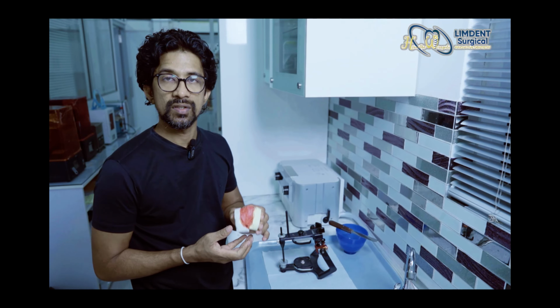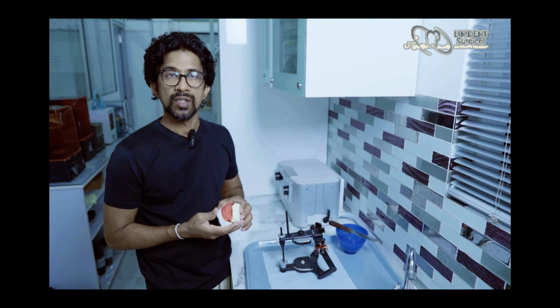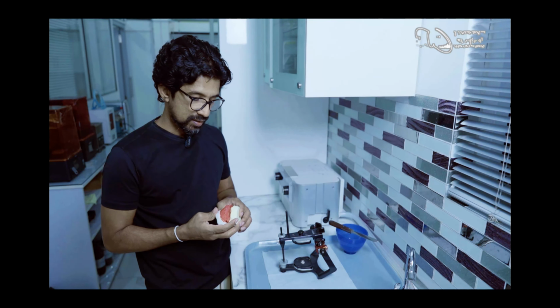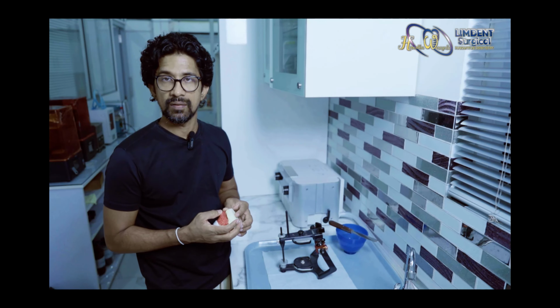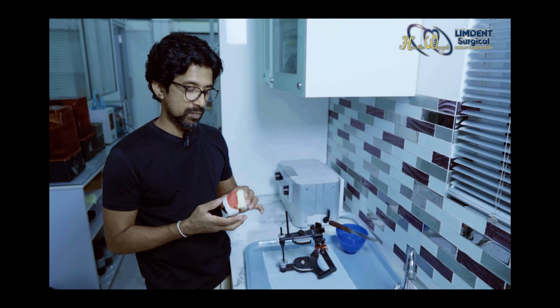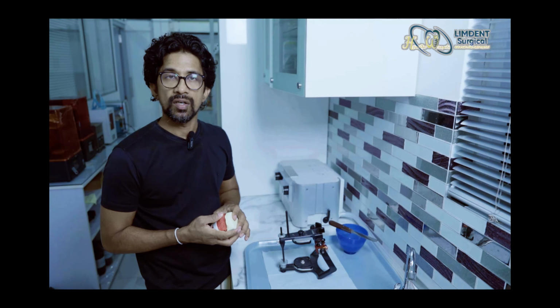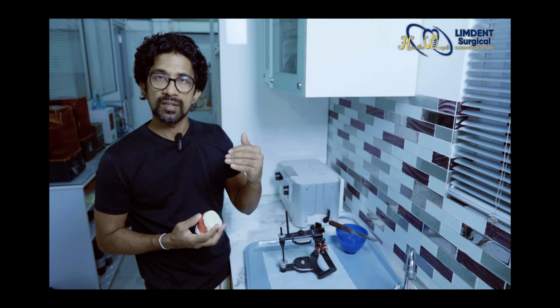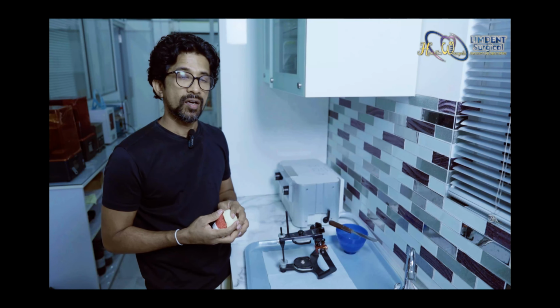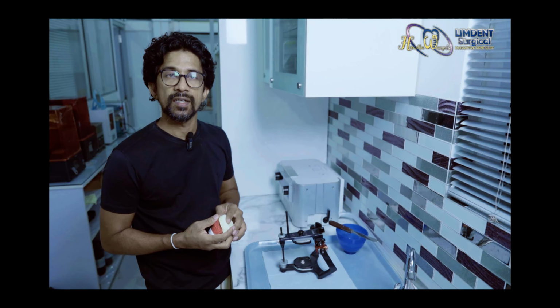At the same time, there's another use of this bite registration with a wax bite, that we can go planning into the digital dentistry. That is a method that I'll be using on my cases. Still, I would like to go ahead and mount the case on an adjustable or semi-adjustable articulator, because we are moving into digital dentistry from traditional dentistry, and we have the confidence in that, because we have been using it with our patients.